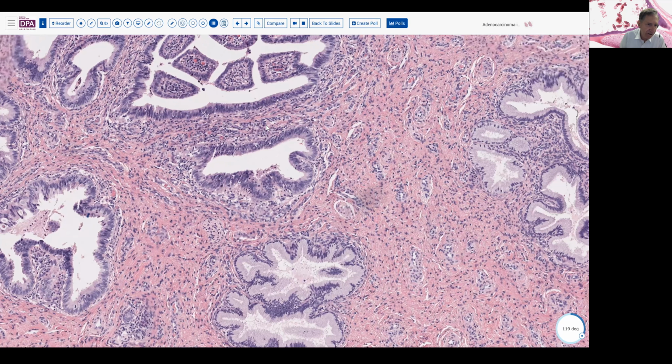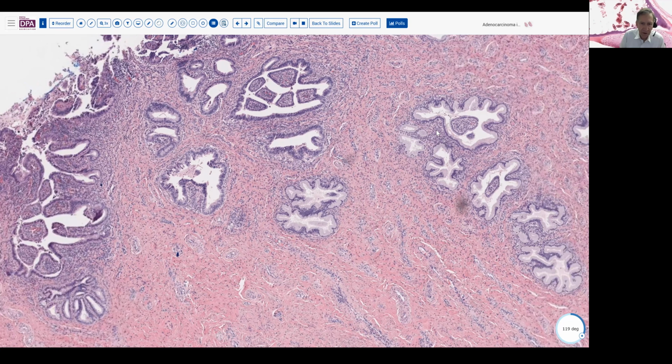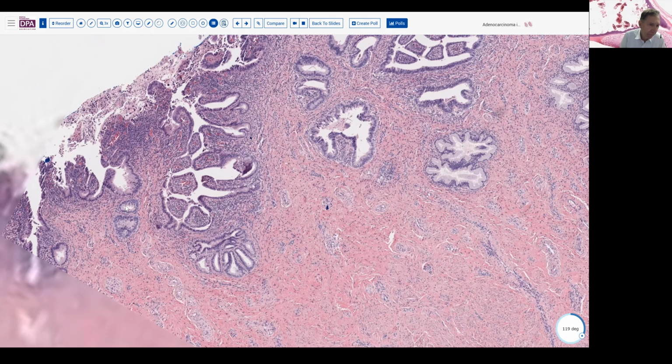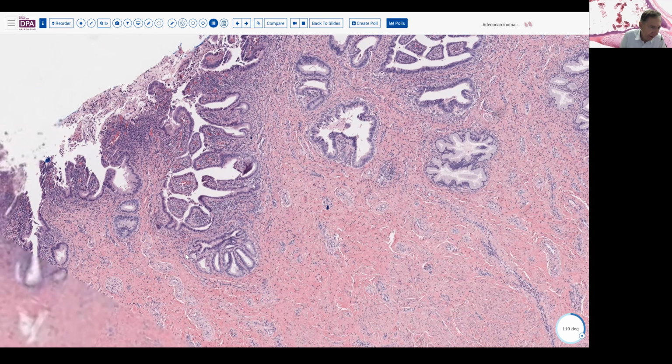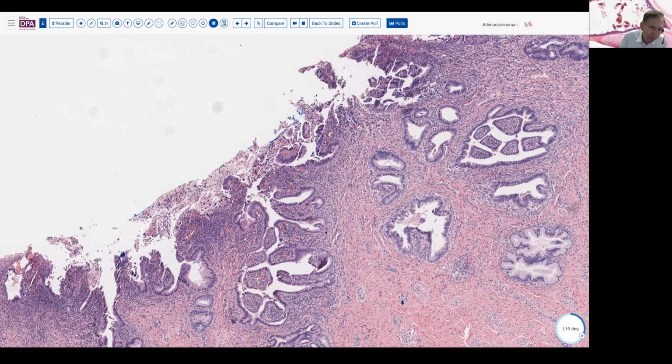Now, because these glands are of the size they are and at a depth comparable to these other benign endocervical glands, I would presume that this is still in situ disease here, here, and same thing here. And you can sometimes see partially involved glands, like maybe this is a partially involved gland. On the surface, again, we see why these cells look different when seen on Pap test.